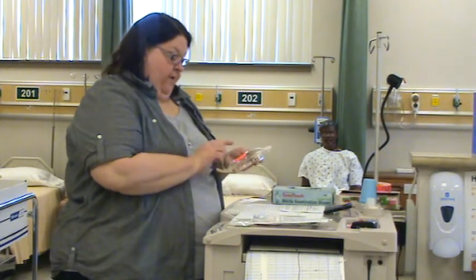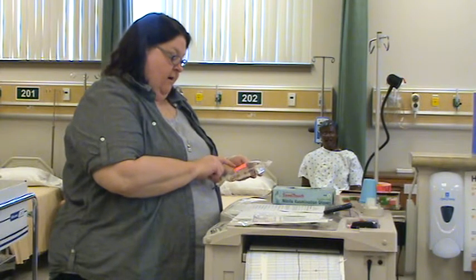Perform first medication check. For Winnie the Pooh, bed 211, MRN 1929-569, I need 250 milliliters normal saline with 125 milligrams Diltiazem at 10 milligrams an hour IV due now. I have, for Winnie the Pooh, 1929-569, Diltiazem 125 milligrams, mixed on the 5th at 10:05, so it's still good — expires on the 6th. The main bag expires May 2015. It's normal saline, 250 milliliters, clear and colorless with no floaties. IV due now.